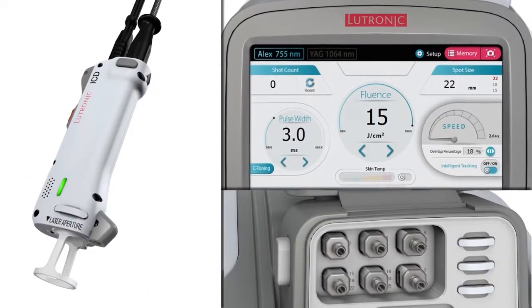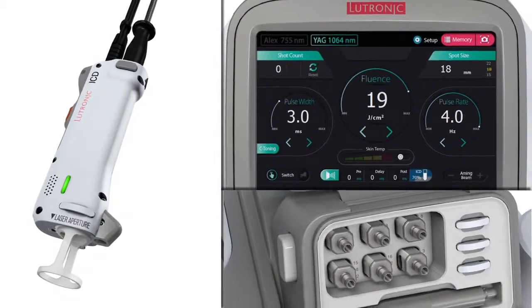Clarity 2 integrates science and innovation into the art of delivering effective aesthetic treatments.